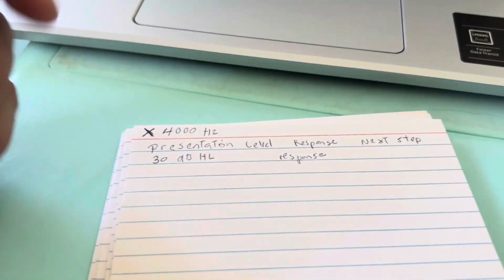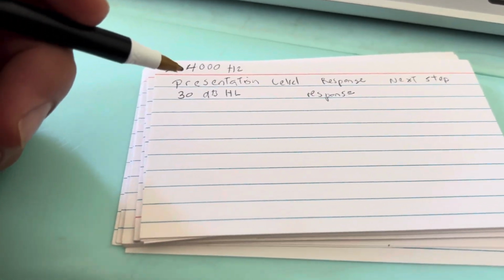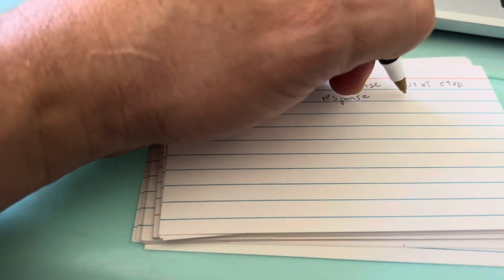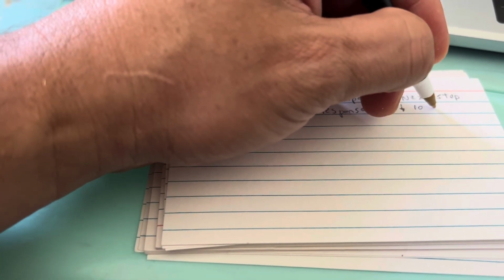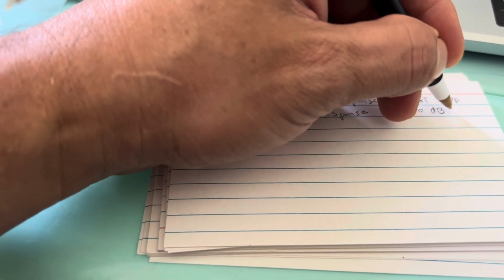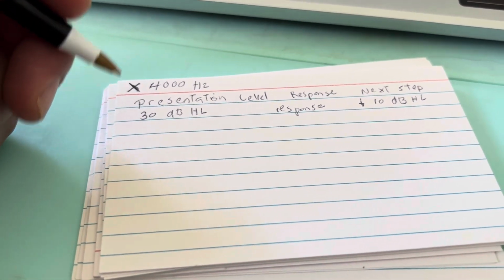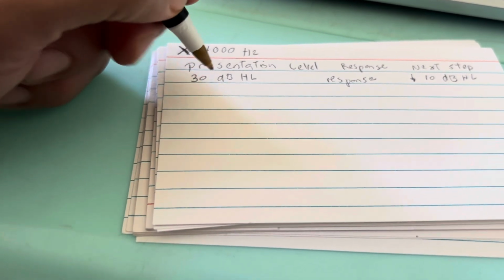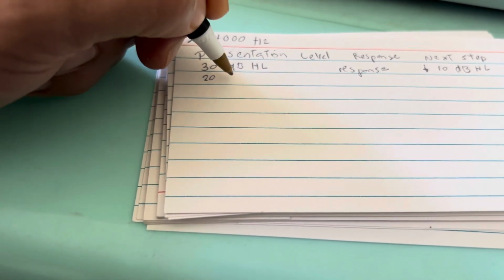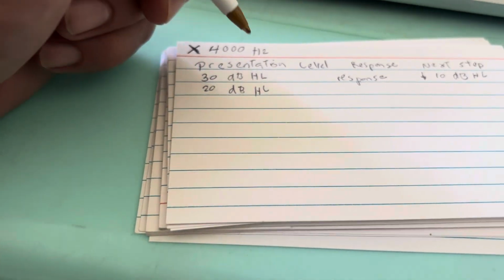And that means that if there is a response, we must go down by 10 decibels hearing level. That would make it 20 decibel hearing level.